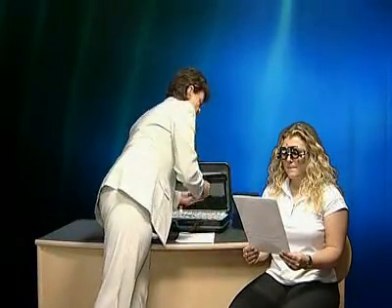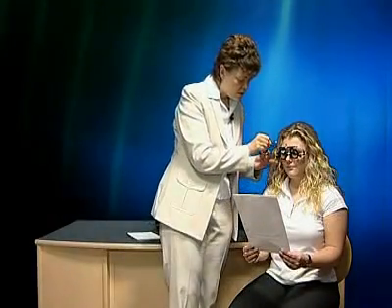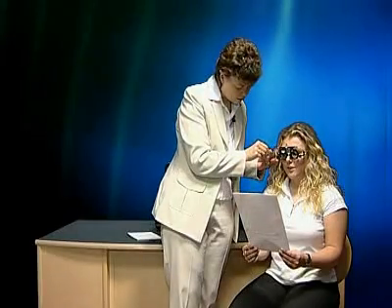Once the reading test is completed, we know what reading ability Zara has. You then reposition the trial frame and give them some near vision text or a paragraph to read quietly to themselves — using this to ascertain which filters work best. Filters for reading disorders start with the cooler colours of the spectrum, as these give very good results, although all filters should be used. I just want you to tell me when it becomes more comfortable or easier to read. Testing through the filters — with one filter there is an improvement.